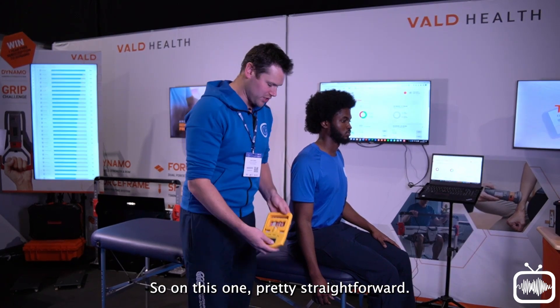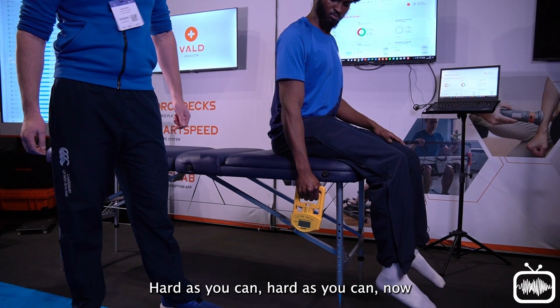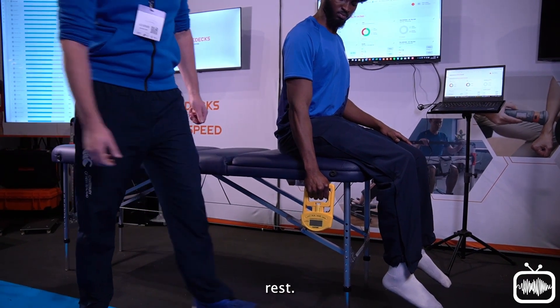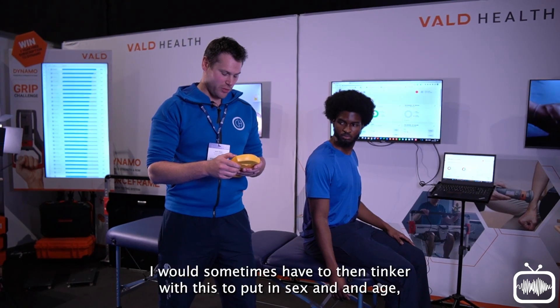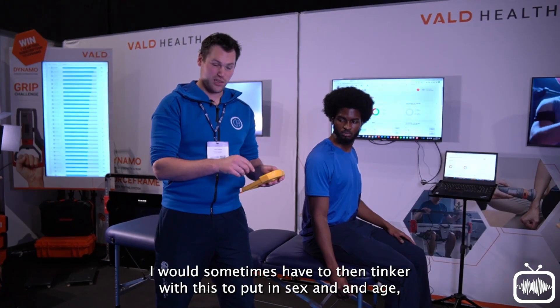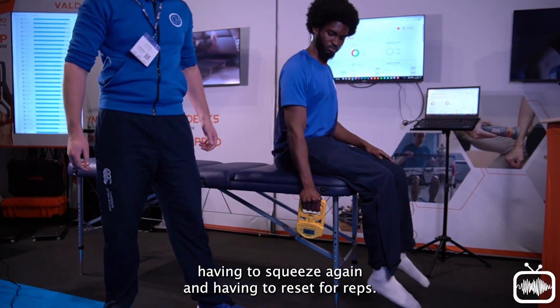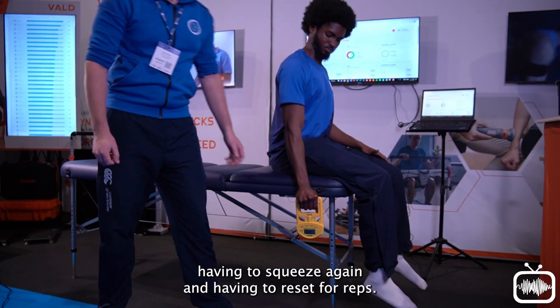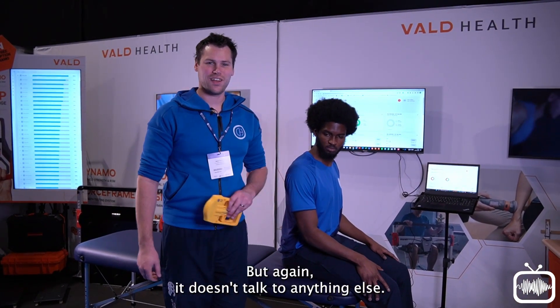On this one, it's pretty straightforward — give it a squeeze as hard as you can, and rest. What I then have to do is reset, sometimes tinker with it to put in sex and age, squeeze again, and reset for reps. So it works, but it doesn't talk to anything else.